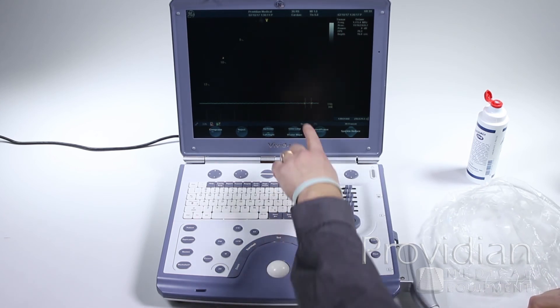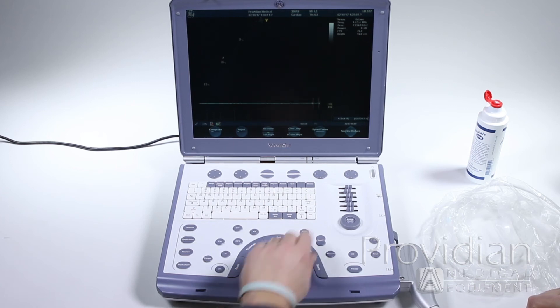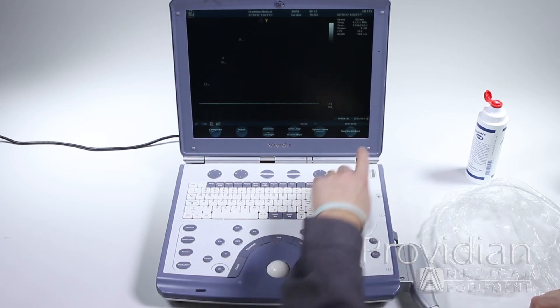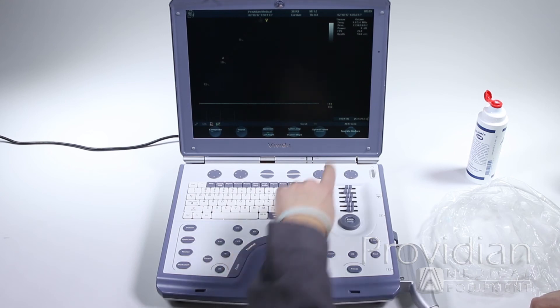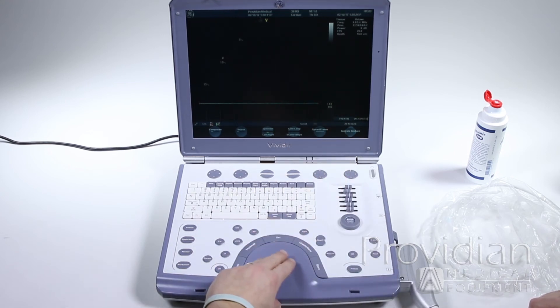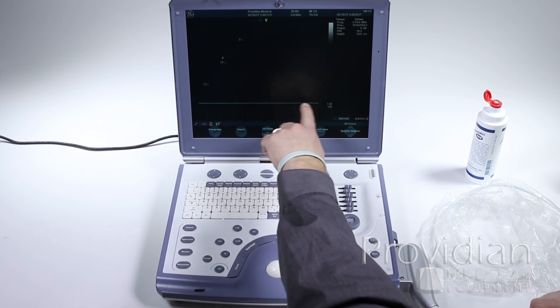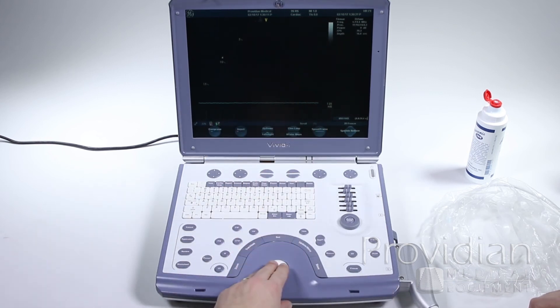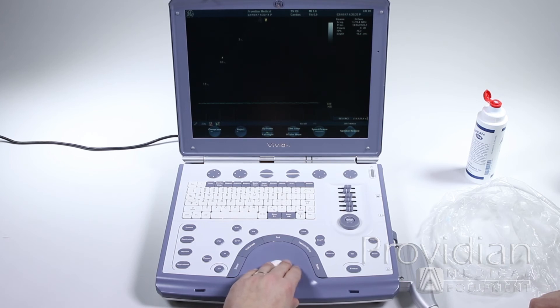I can just scroll back through, and this little red line tells me where I am on the ECG, and this shows me about how far I am. I'm at 14 seconds. This is the frame count here. I'm at frame 877. This shows me if I have an ECG, it'll show me the heartbeat from beat to beat, and I can see that exactly through there.